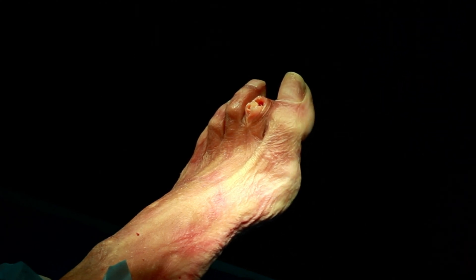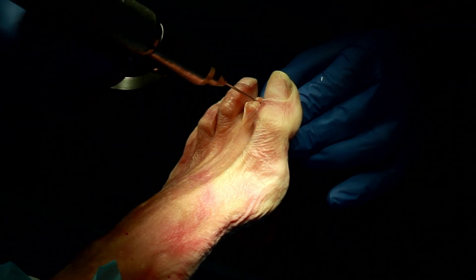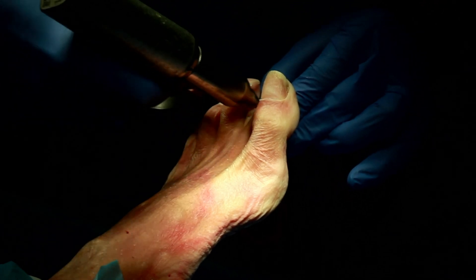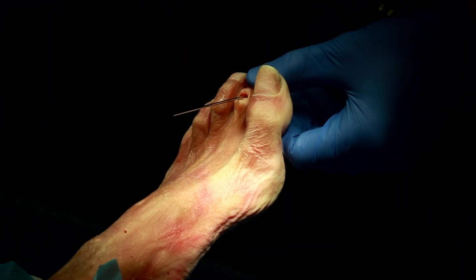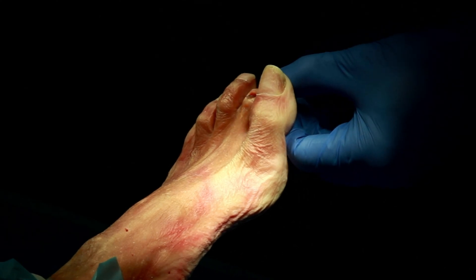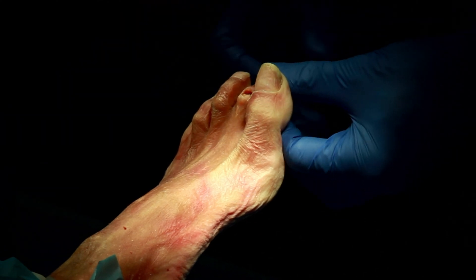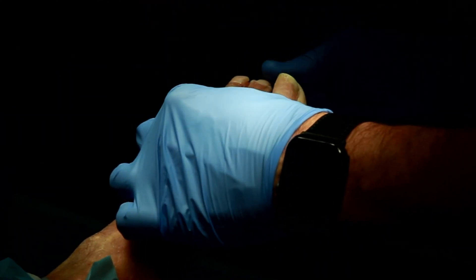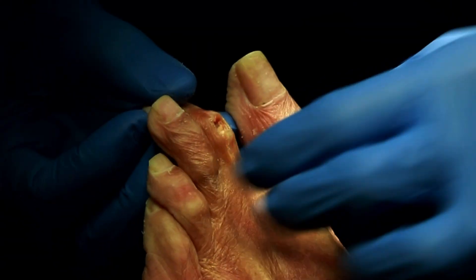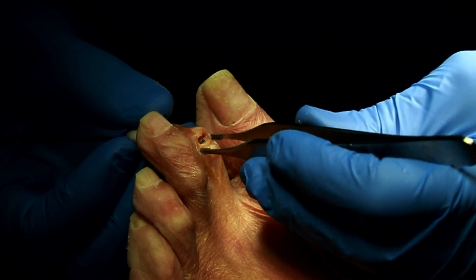Now go back to the same K-wire you used for the pre-drill, and drive it down the same pilot hole in a retrograde fashion — keep the toe extended. Bring it out retrograde just barely so you can put that tip into the pilot hole; it sits in the middle of the peg. Lift it up a little bit to get it there, then grab it with the forcep.